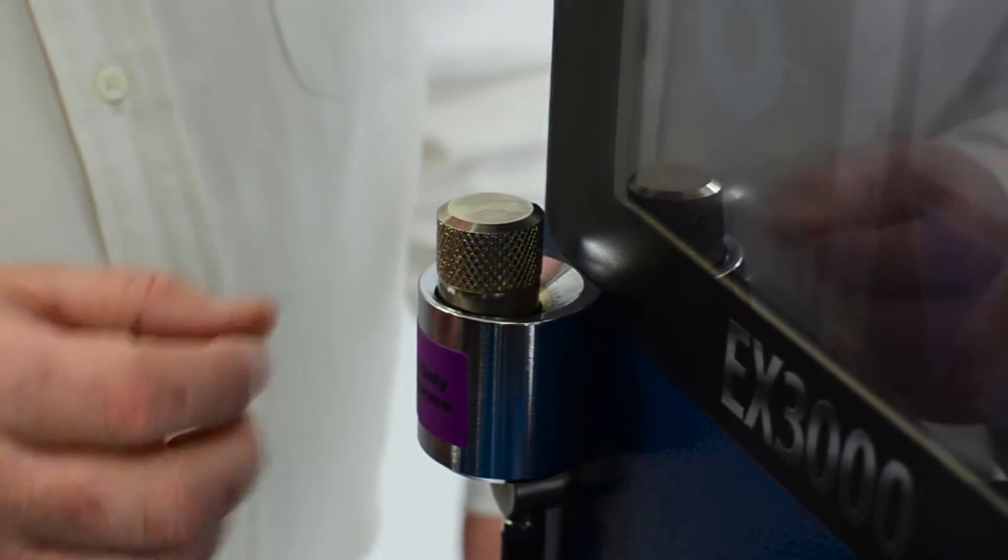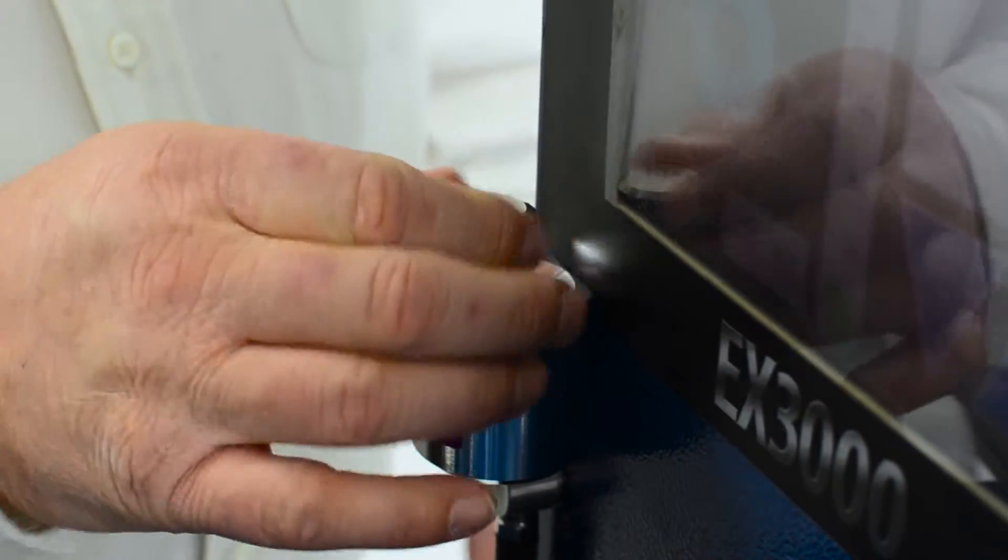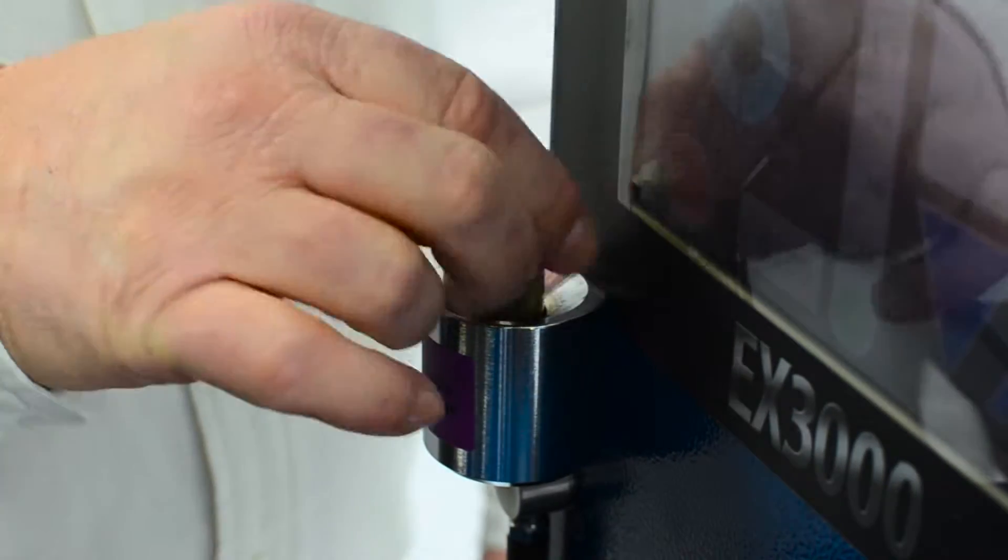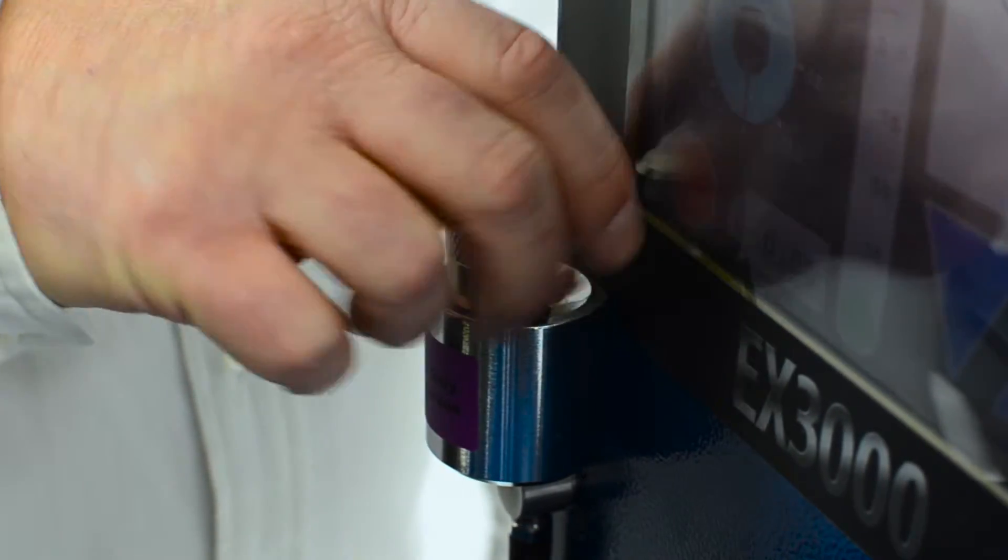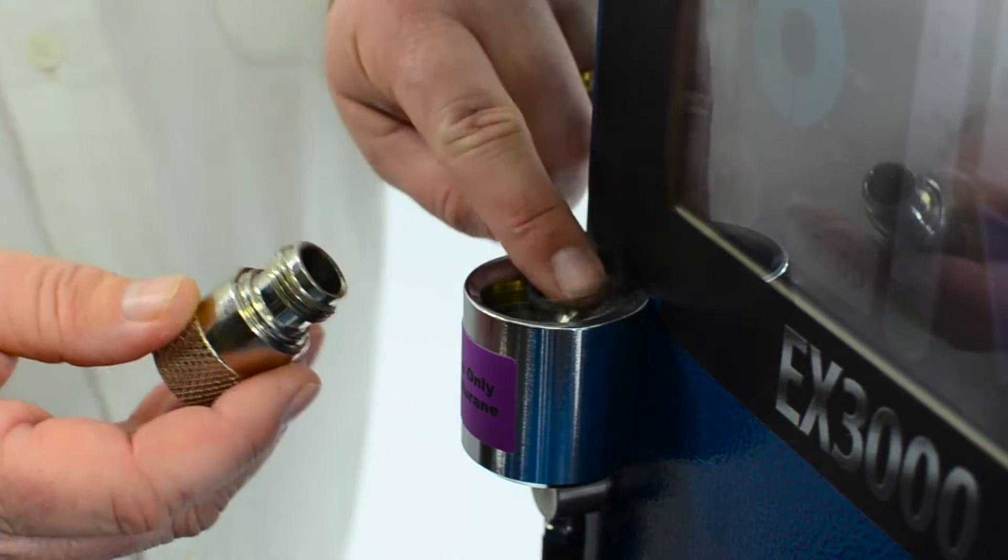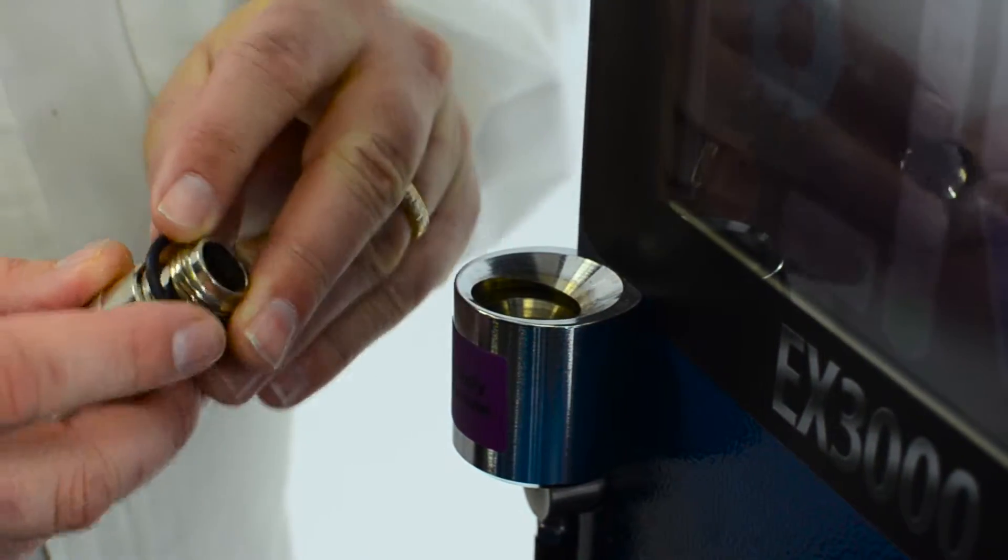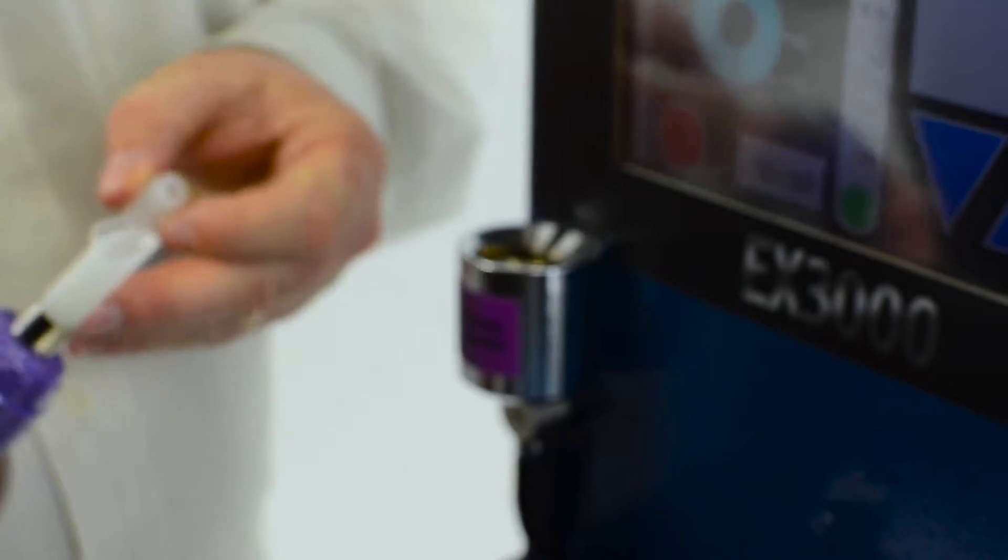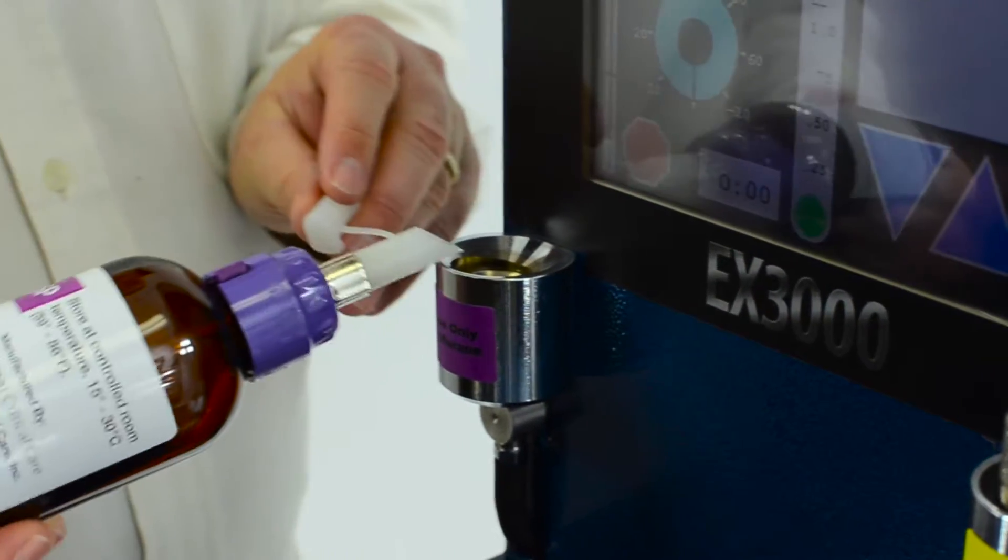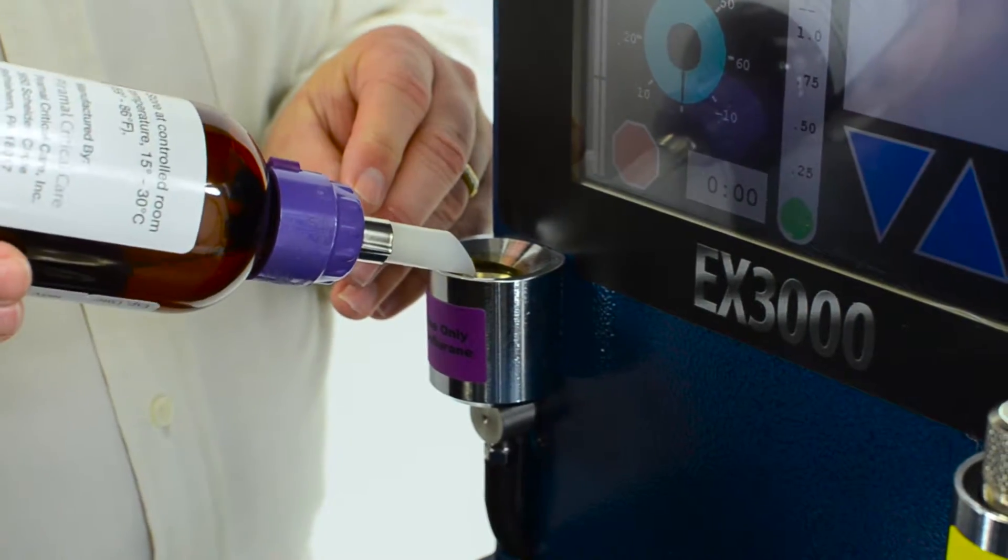To fill the isoflurane vaporizer you'll just unscrew the plug here. Remove the plug and there's an o-ring that's the seal. Make sure you don't lose it. And we'll take our anesthetic and pour it into the funnel.